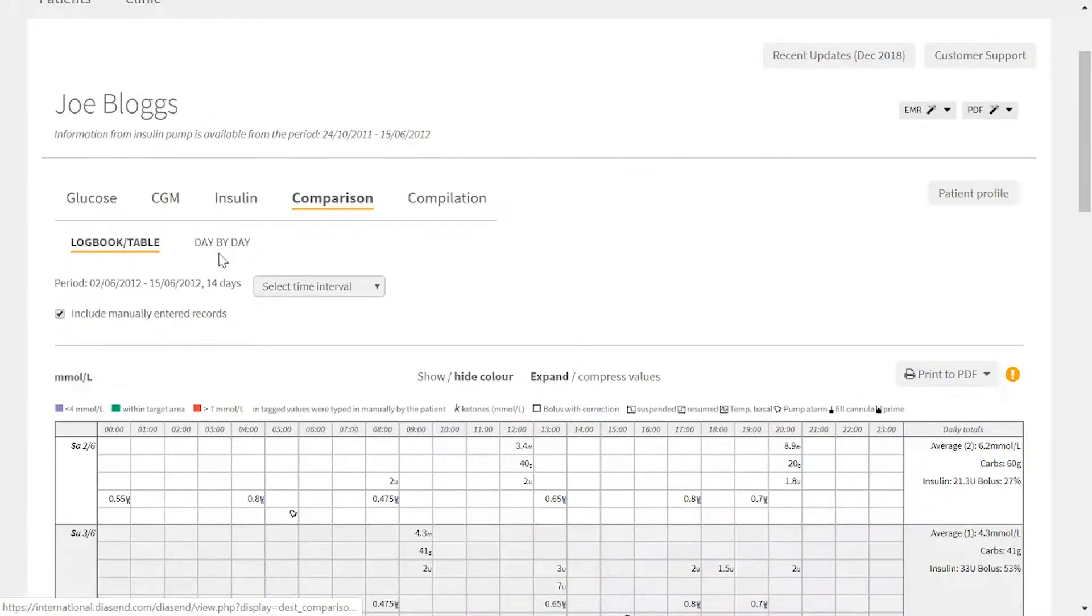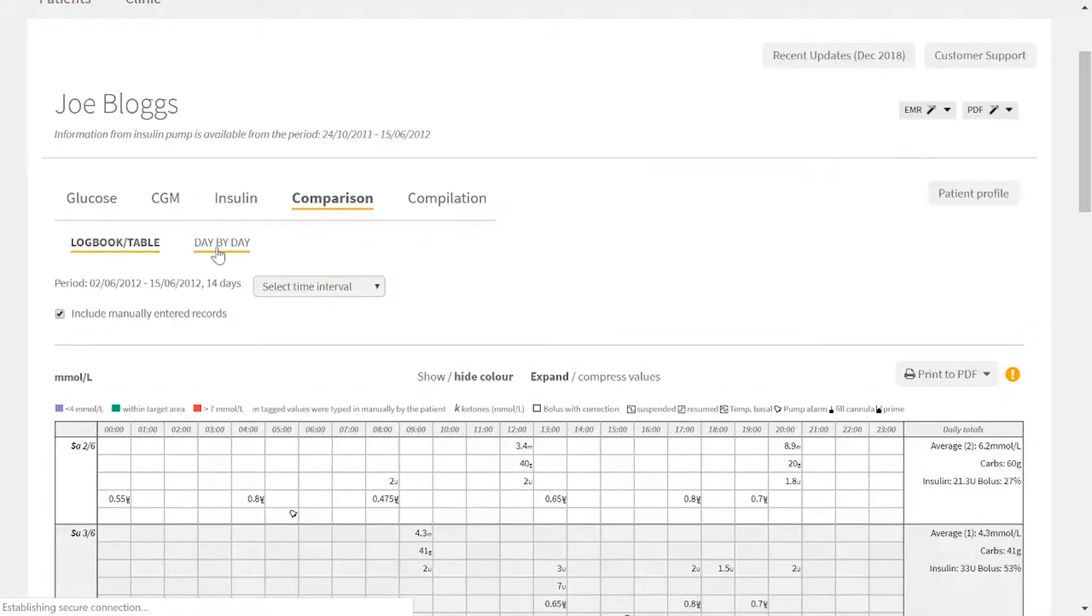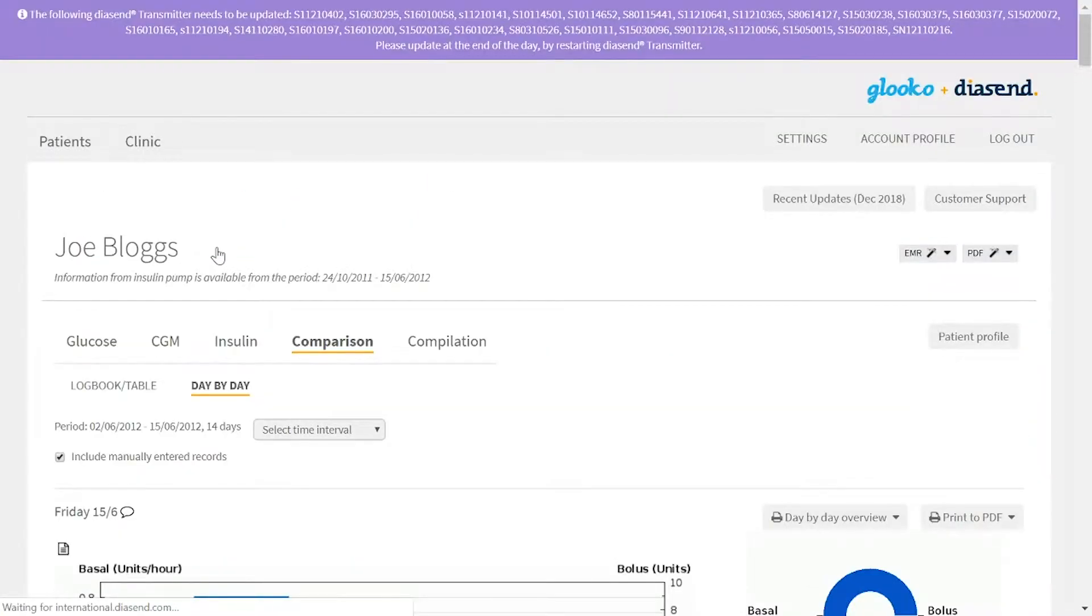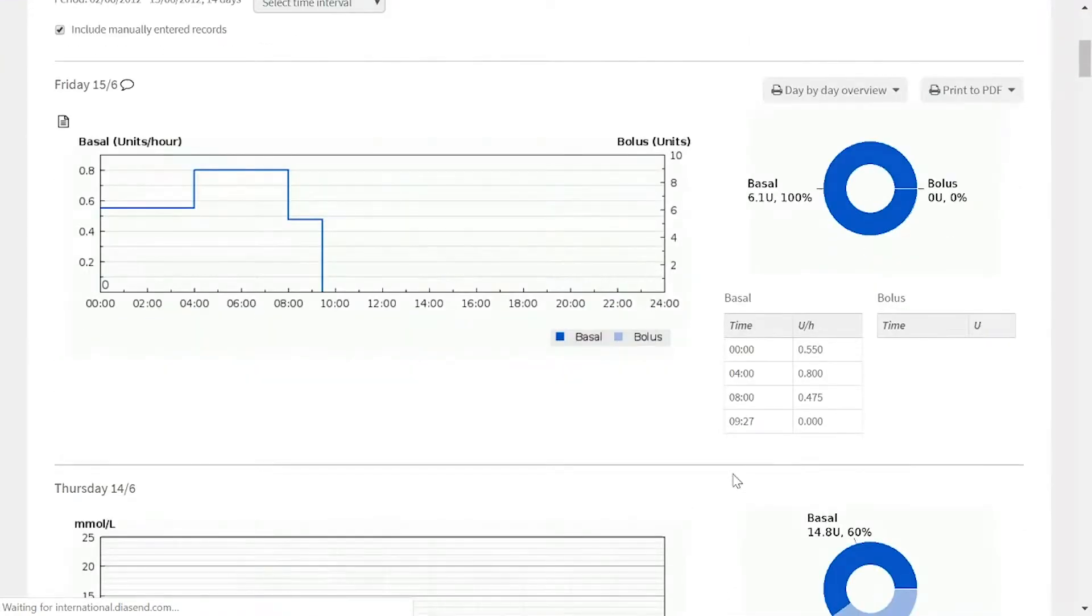If we click onto the next tab we find at the top, day by day, we're actually shown the graphical information for all of these categories grouped in day.